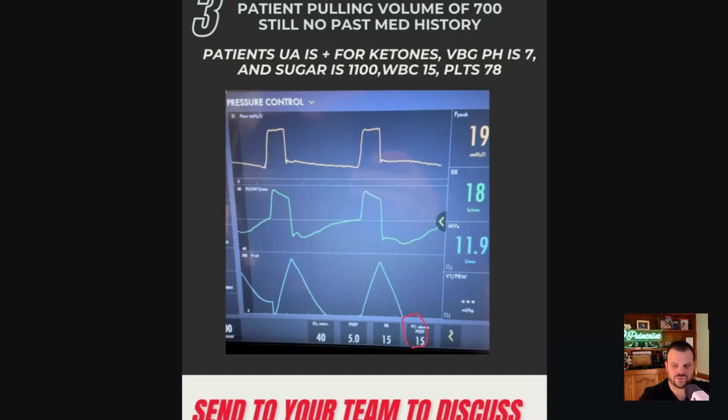So that's the first issue. I just put driving pressure there to sort of purposely confuse people, but ultimately I want to bring up the point that when we talk about driving pressure in pressure control, really in any mode, but pressure control, the thing you have to be cognizant of is whether people are referencing driving pressure in pressure control as the set inspiratory pressure.